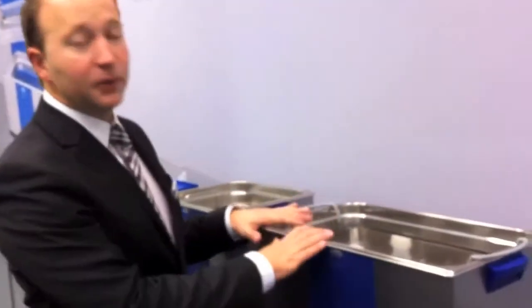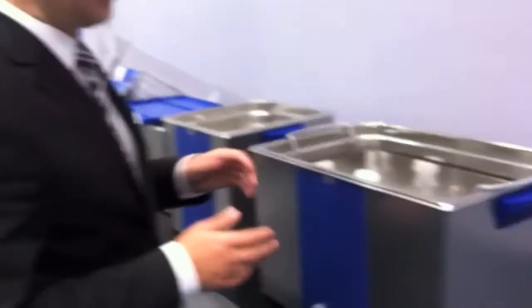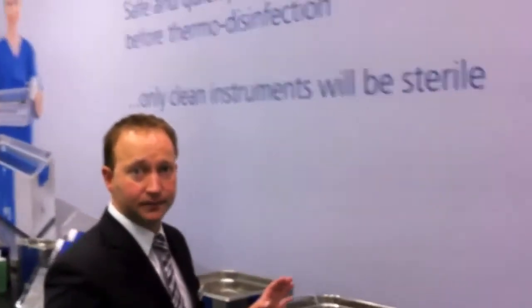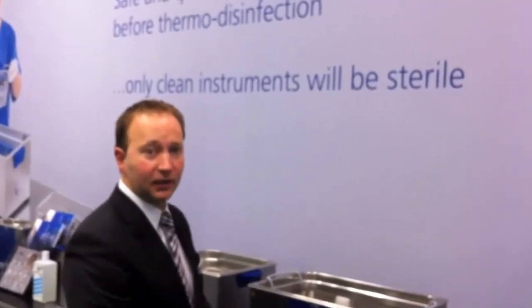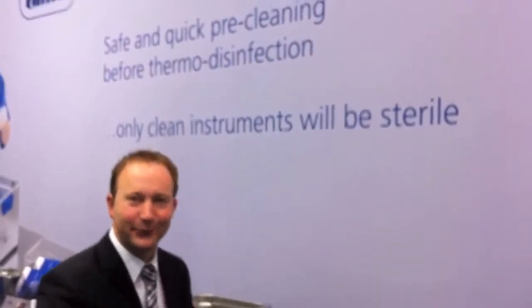The benefit of the tabletop units is that installation is very easy — it's just a plug and play thing. You just plug it in, fill it with water, add your detergent and you can start working. It's easy to sell, easy to install, maintenance free, and therefore a very attractive helper in CSSDs or other dental or medical practices. Thank you for your attention.